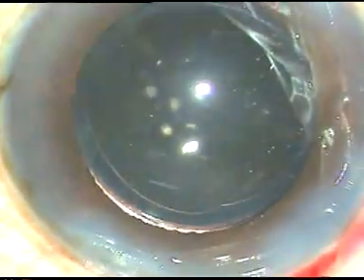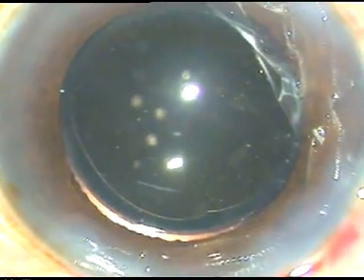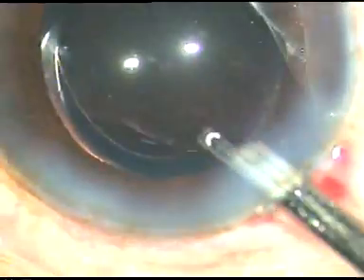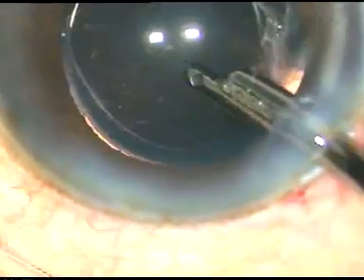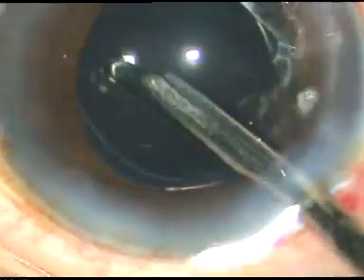A final lavage of the anterior chamber is done, and see how beautifully the viscoelastic substance from the corneal endothelium comes out — you could see the viscoelastic substance came out. Then go behind the IOL and do some irrigation and aspiration of the capsular bag.